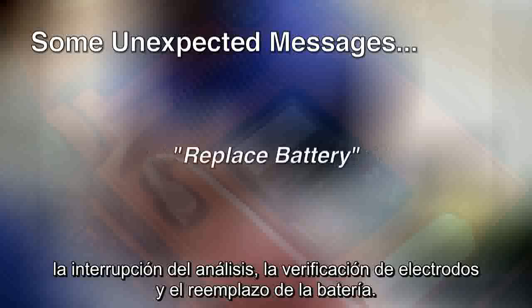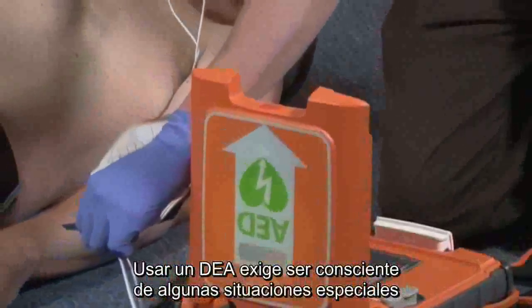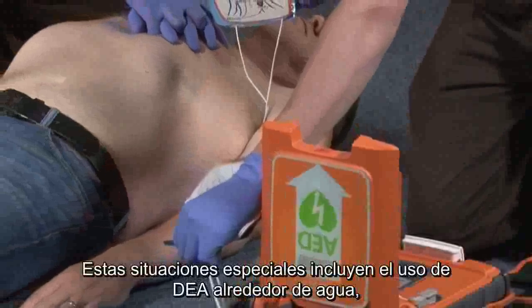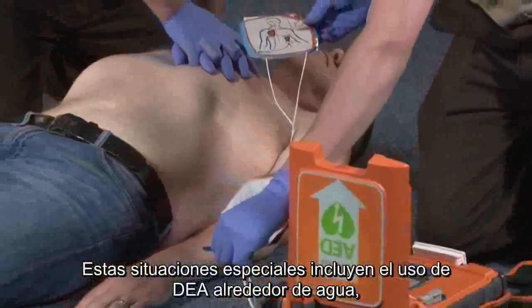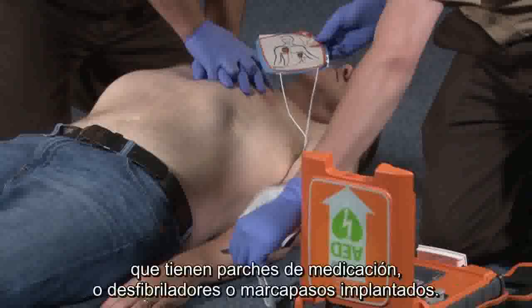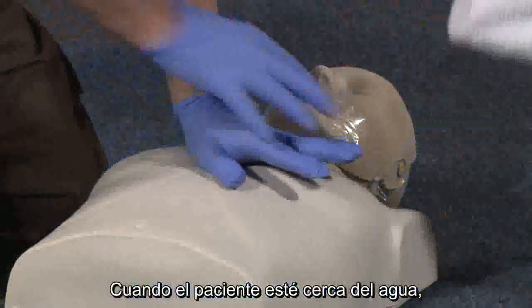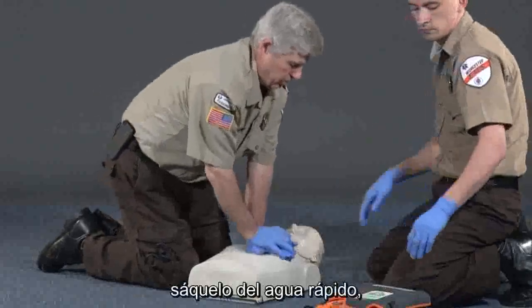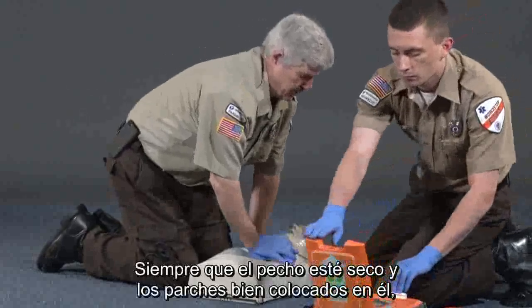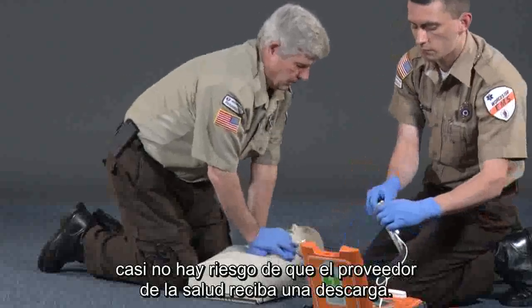and replace battery. Using an AED requires awareness of some special situations so you can take appropriate precautions and action. These special situations include use of AEDs around water, the age of the patient, trauma, and patients who have medication patches or implanted defibrillators or pacemakers. Whenever the patient is near water, quickly move the patient out of standing water, dry the chest, and apply the electrode pads. As long as the chest is dry and the pads are firmly attached to the chest, there is little risk of any shock to the healthcare provider.